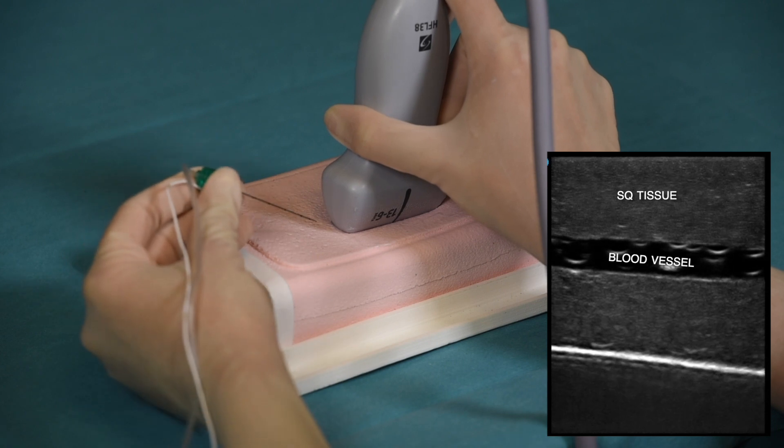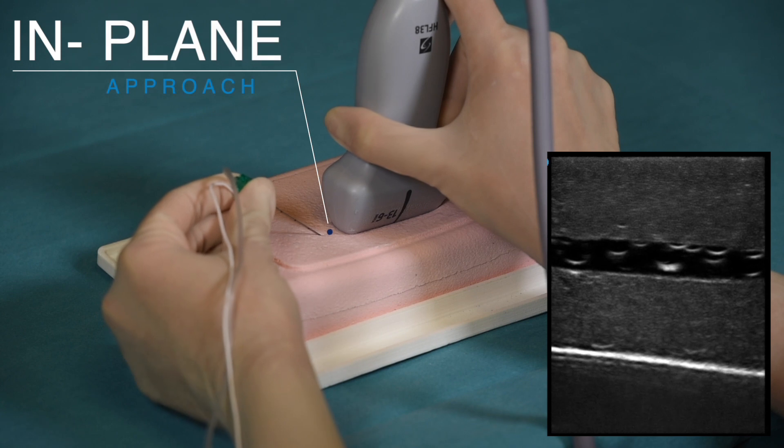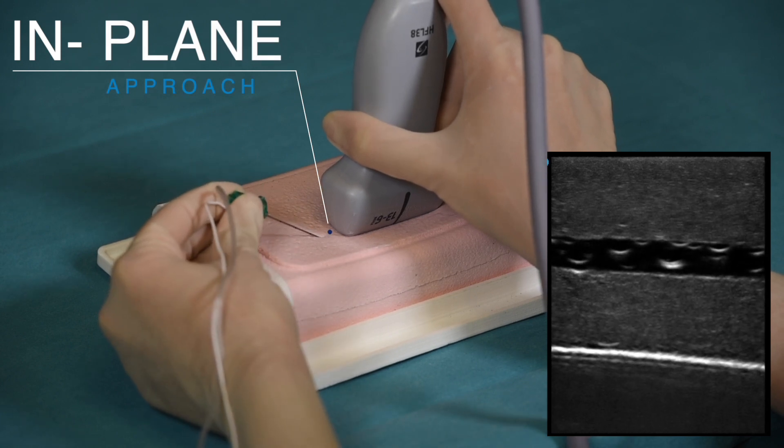Here we can see a blood vessel in longitudinal axis. We will practice needle insertion in-plane to access the blood vessel wall in the longitudinal axis.